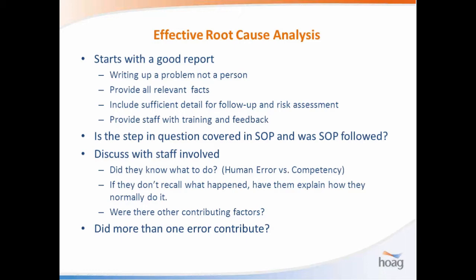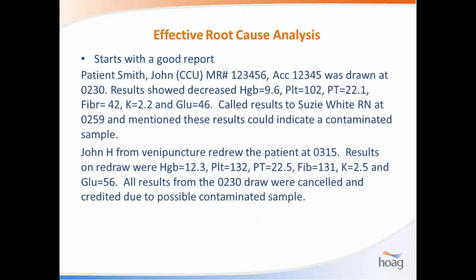And were there other contributing factors? Was there inadequate staffing that night? In this day and age of monitoring productivity and cutting FTEs, that can be good ammunition for you for justifying positions. And oftentimes, maybe there were multiple errors that lined up that contributed to this.